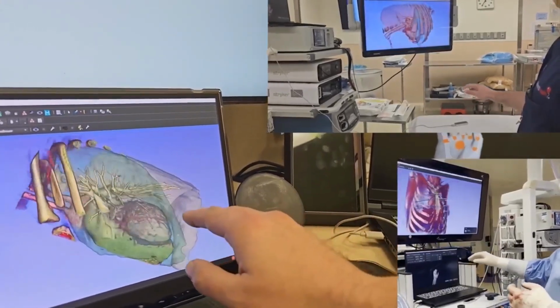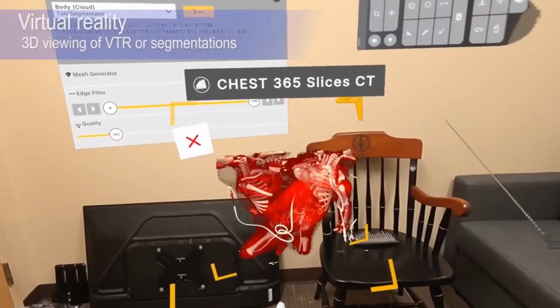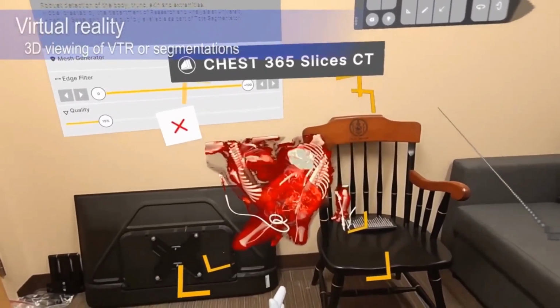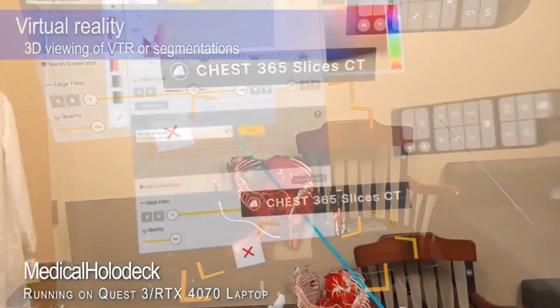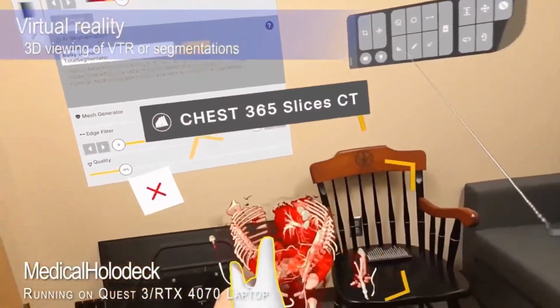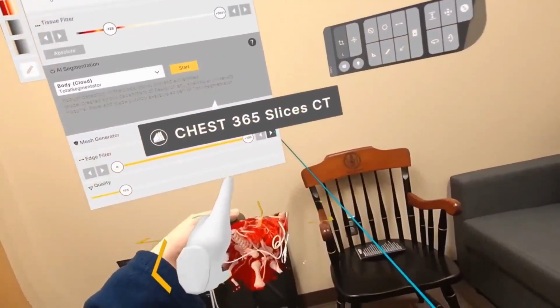From there, the laptop is just connected to the OR display system. For really complex problems like the conjoined twins I mentioned earlier, looking at the images in virtual reality can be really helpful. The ability to see depth with volume rendering images makes it a lot easier to make sense of the anatomy, and you're no longer limited to the standard planes of imaging.